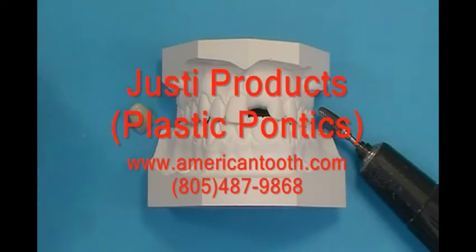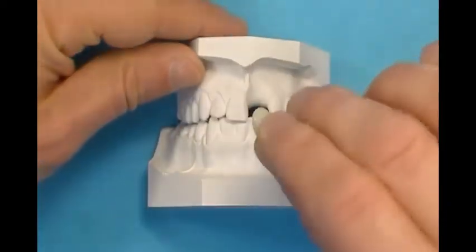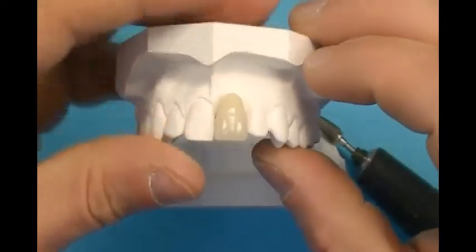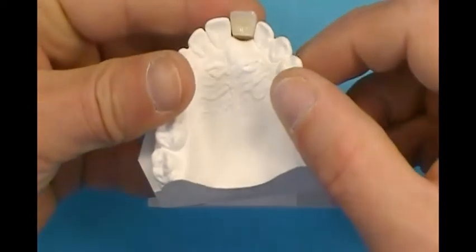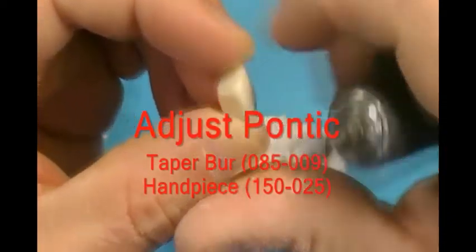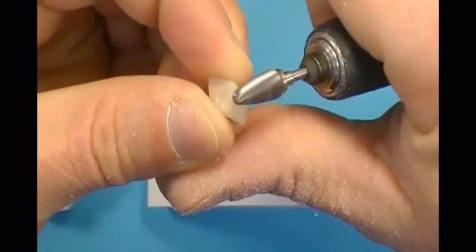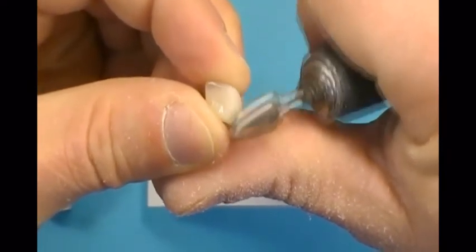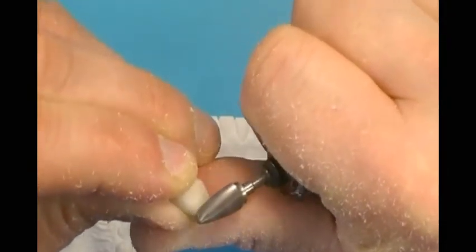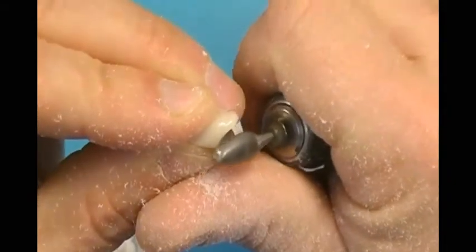The Hawley Retainer can be designed to include a tooth or teeth within the acrylic foundation. A plastic tooth of desired shade and size is selected to fill the edentulous space. Usually these plastic teeth require some adjustment. Adjust the preformed pontic using a carbide taper bur and a lab handpiece. Trim along the mesial and distal sides of the pontic to fit it within the edentulous area, and trim along the base of the plastic tooth to adjust height. Incisal adjustments are only made at the end of the appliance fabrication process.